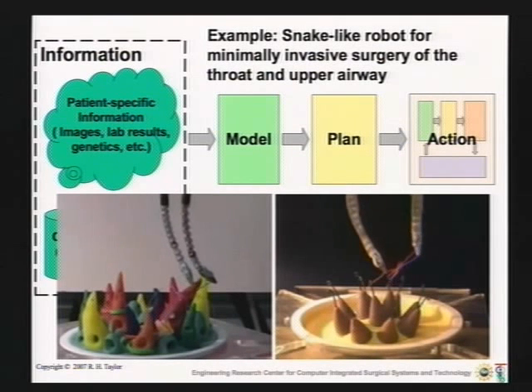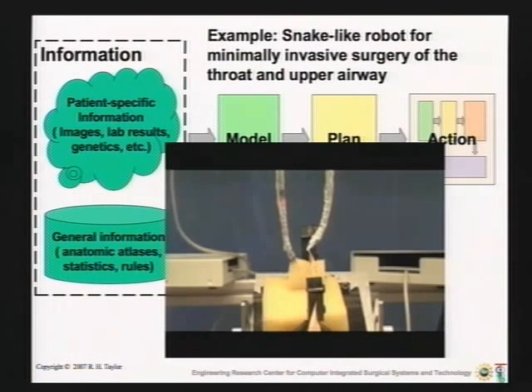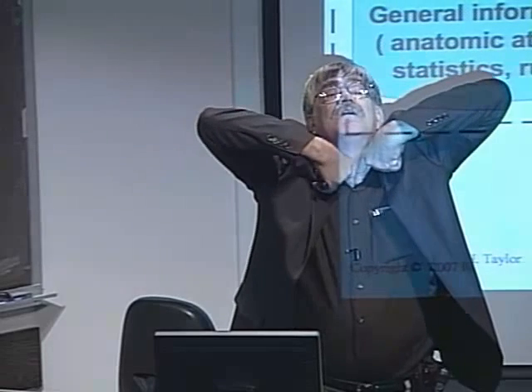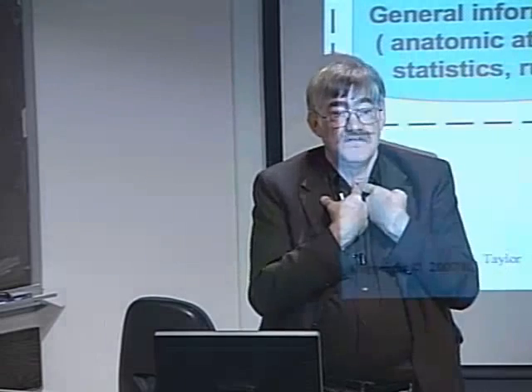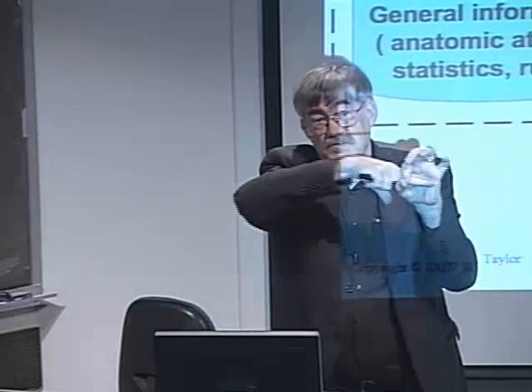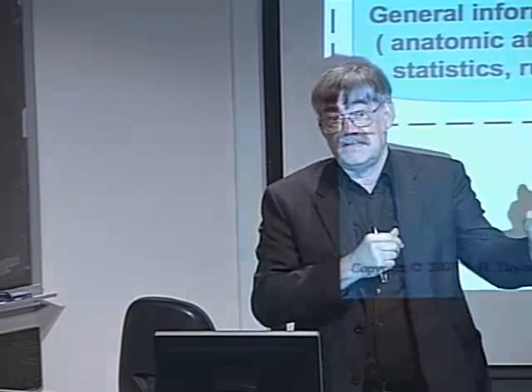This is just showing the robot suturing. Here's maybe the most recent video, and here our initial application is going to be taking two of these in parallel through, still in phantom, but down to suture below the vocal cords. The advantage of this kind of robot is you can get both tools with very high dexterity into a confined space through a single access port.